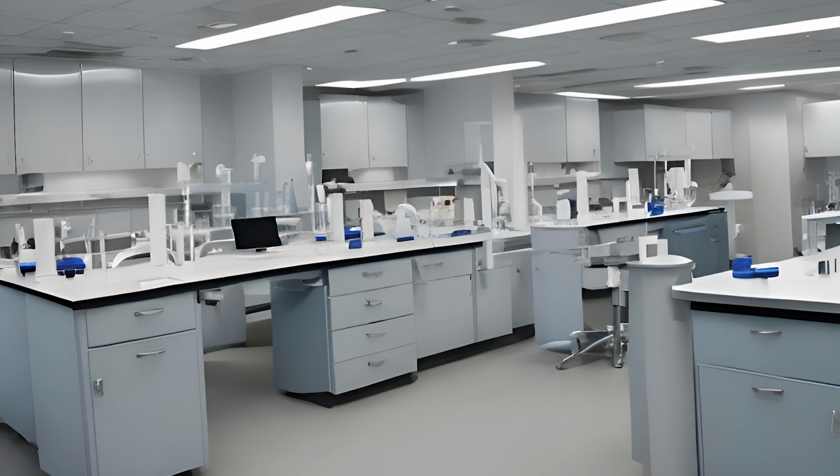When selecting a site, you want to avoid drawing from a burn, a scar, or a tattoo. You want to avoid drawing blood from a damaged vein or a hardened vein or a clotted vein. You also want to avoid drawing from a valve in a vein.